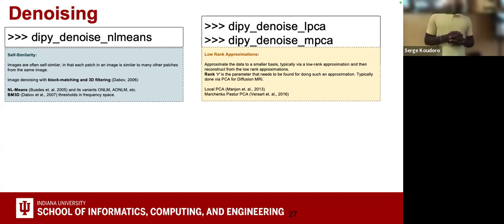For that, you use, for example, SVD, singular value decomposition, which takes one matrix, your data, so your block of voxels, and decomposes it into 3 other matrices, and you keep only the matrix with the most relevant information. Again, this is oversimplified, but it's really to give you the general idea of this family of algorithms.